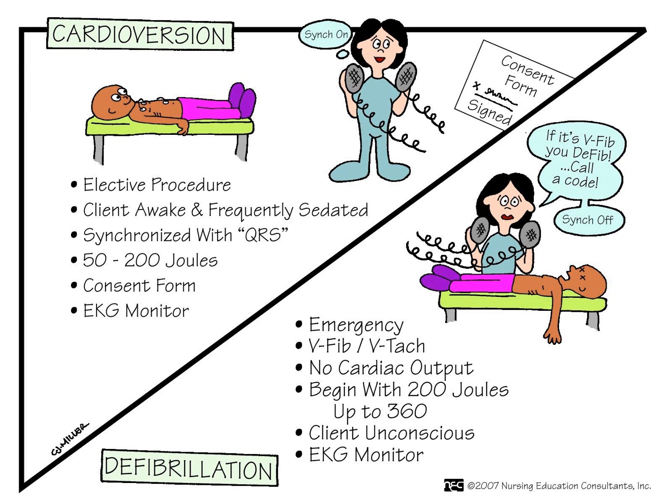The shock dose used for synchronized shock is lower than that used for defibrillation. As you can see in this picture, it says 50 to 200 joules. Okay. The treatment is going to depend on the level of the hemodynamic compromise. But when you press the sync key on the defibrillator, it enters sync mode. And the synchronizing circuit within the defibrillator will detect the patient's R waves. When we press the shock button, the unit discharges with the next detected R wave. Thus, we are avoiding the vulnerable T wave segment of the cardiac cycle.